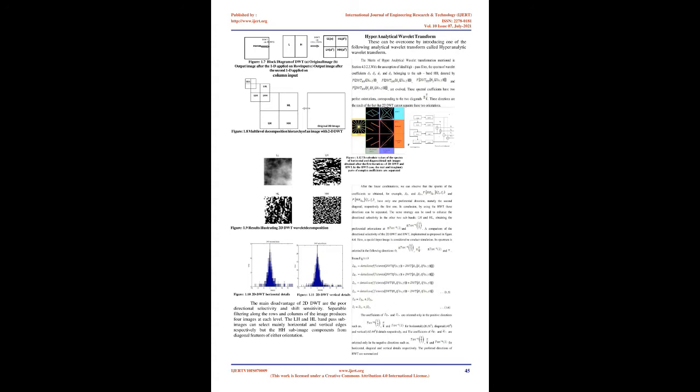Various enhancement techniques, viz., histogram equalization, neighborhood-based contrast enhancement algorithm, selective median filtering enhancement method based on multi-scale analysis etc. may be used for enhancing the contrast of mammogram images. Mammographic images utilize a narrow range of gray levels, without a well-defined histogram structure. Thus the conventional histogram equalization techniques may not be suitable in enhancing the mammogram images.